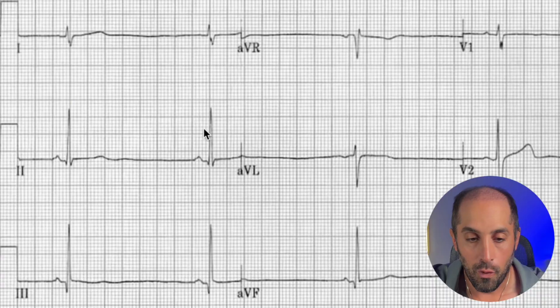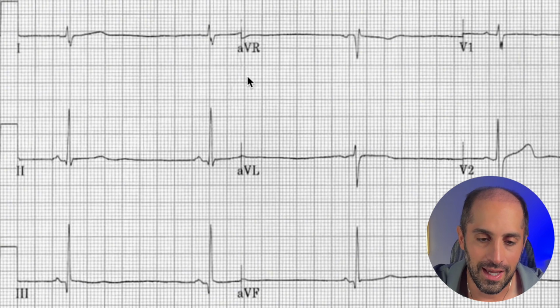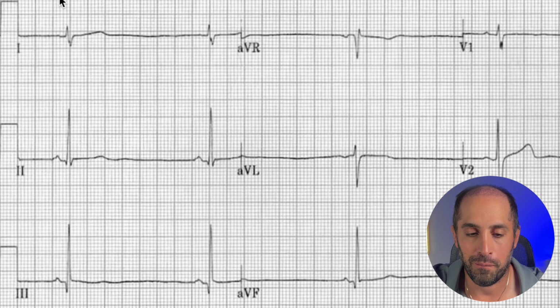You've got to be able to march out the P waves, march out those QRS complexes, and make sure that they are coordinated. In our patient, when we did this, we got sinus bradycardia, but let's go to my favorite EKG website, Life in the Fast Lane, to use one of their examples because it's so important to be able to recognize this pattern. All right, here we are, Life in the Fast Lane, and this patient's EKG is showing a heart rate of about 35 beats per minute.